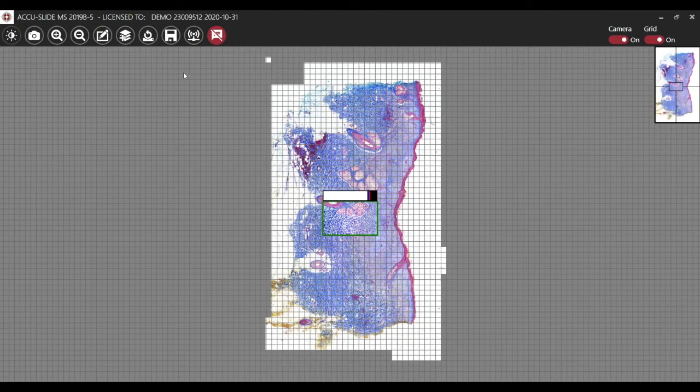If you are not satisfied with the scan, you can return to the Scan Settings step or click the Start New Scan button to restart the scan.